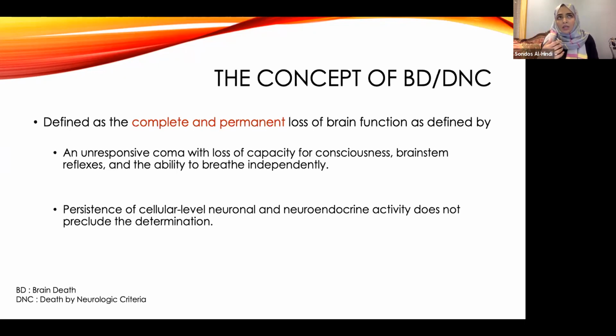when we say cellular level neuronal activity, meaning a very mild, let's say, EEG activity by itself, when you have a clear-cut clinical diagnosis, does not mean that the patient is not brain dead, or does not interfere with your definition.